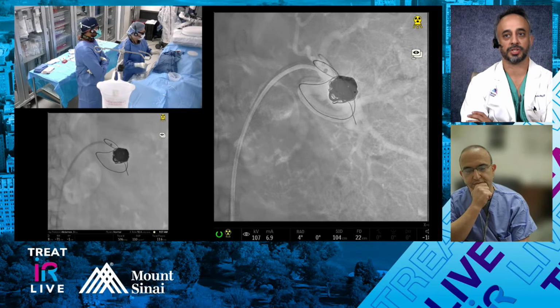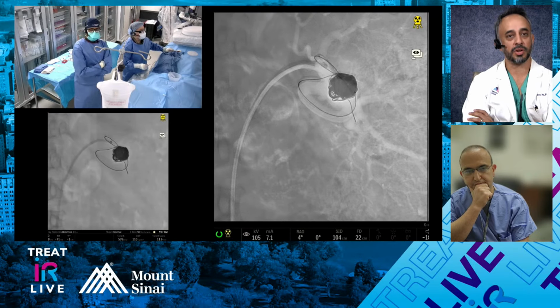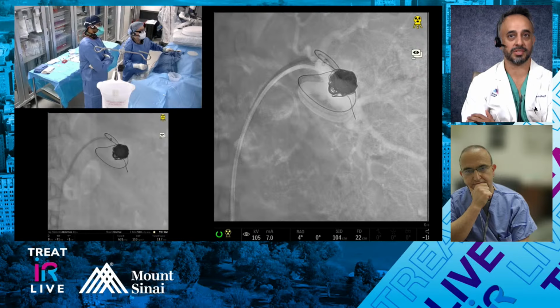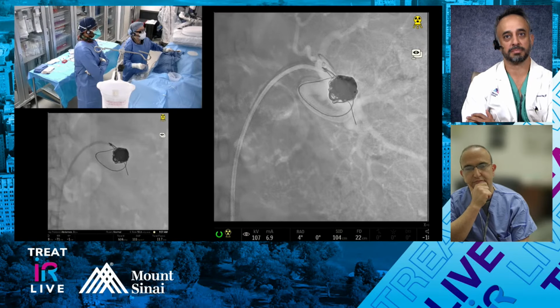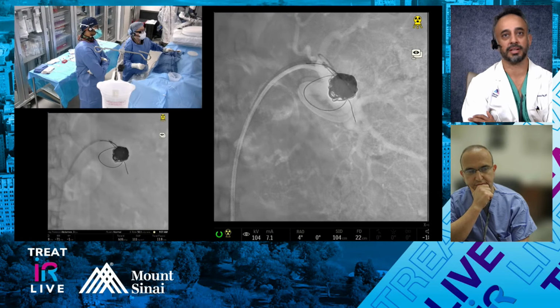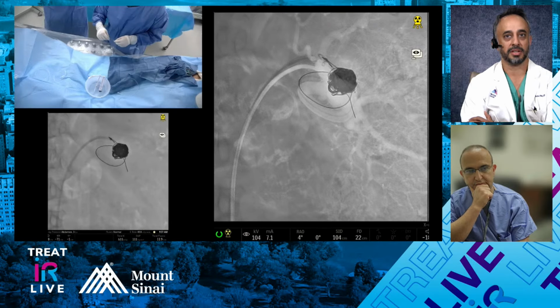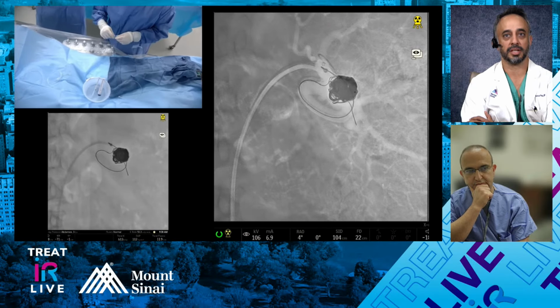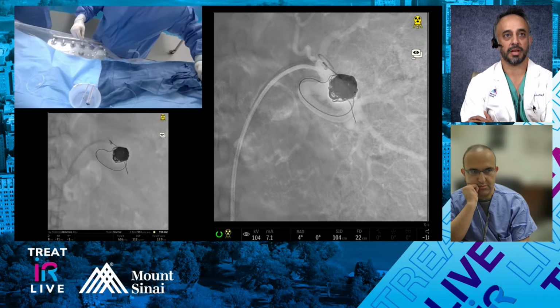I think for giant aneurysms like that, if I can get an 035 catheter out, I would prefer to start using 035 coils just from a time perspective. The problem is the biggest 035, at least that we have, is 20 millimeters, the secondary loop. Usually it's not a big deal because the outflow vessels themselves aren't that big, so you can get away with it. We have 035 interlocks, and that'll work.